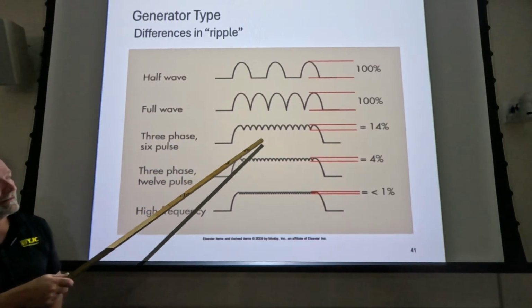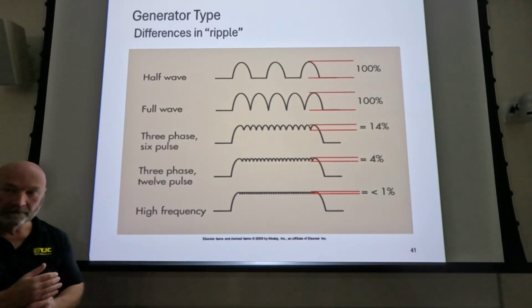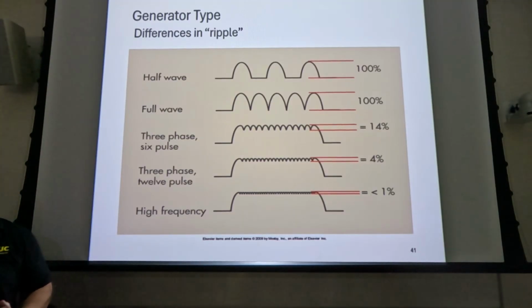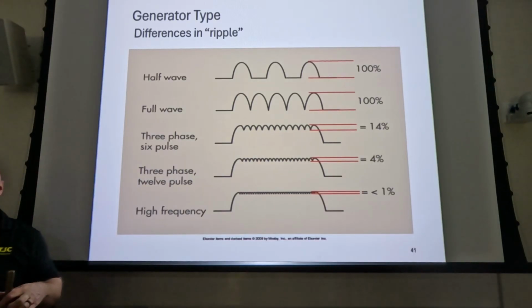Right? So in these three, where does your voltage drop to 0? When you stop making an exposure, right? So it doesn't. So if the voltage never drops to 0, then this voltage ripple indicates the peak to the minimum voltages, right?